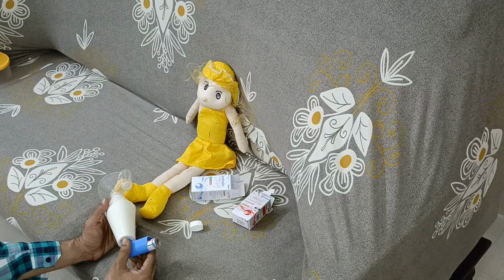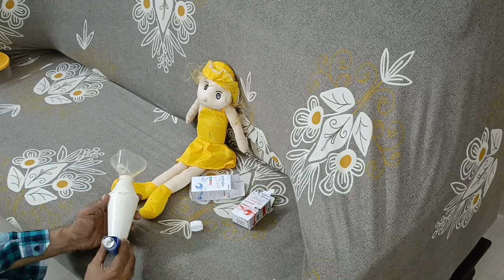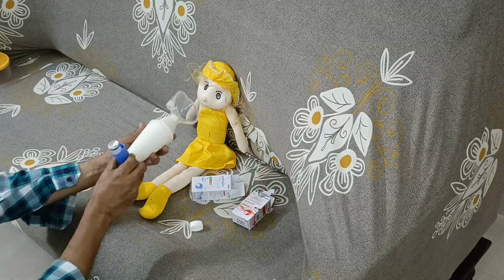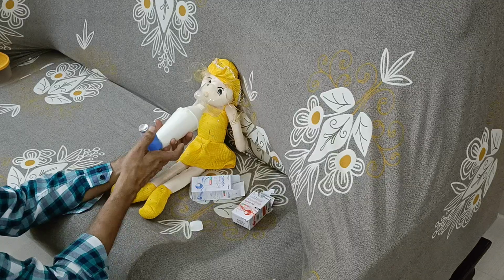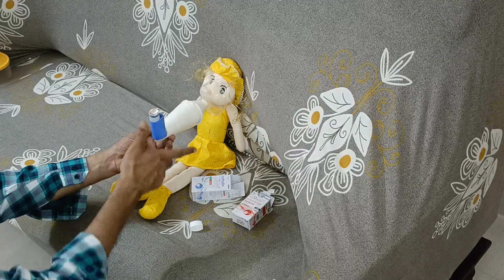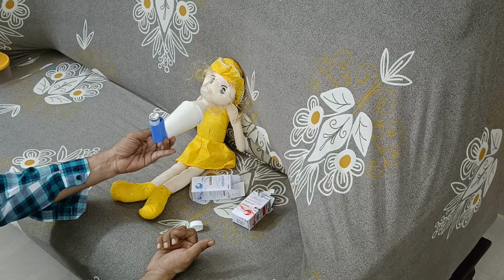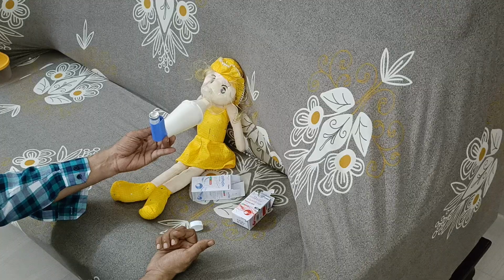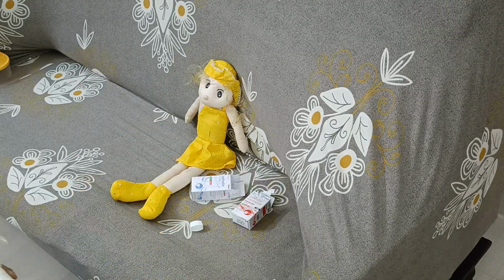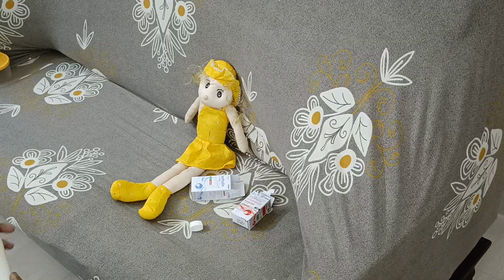Now I'm going to attach the canister over here. Ask the patient. Okay, I'm going to shake the canister this way. I'm going to attach it and place it over here. Now I have to talk to the patient. Okay, I'm going to press down. Take a deep breath. 1, 2, 3. Hold it for 10 seconds. 1, 2, 3, 4, 5, 6, 7, 8, 9, 10. Now you can breathe out. Good boy, you are doing it. That's great. Now 20 seconds are over.